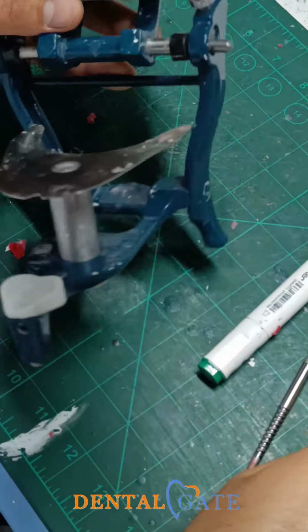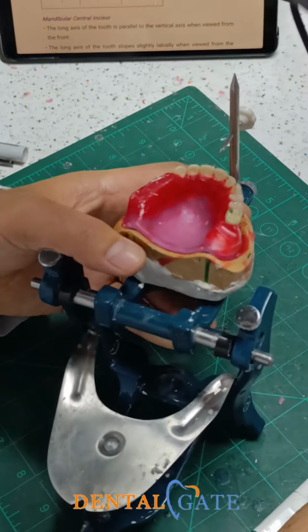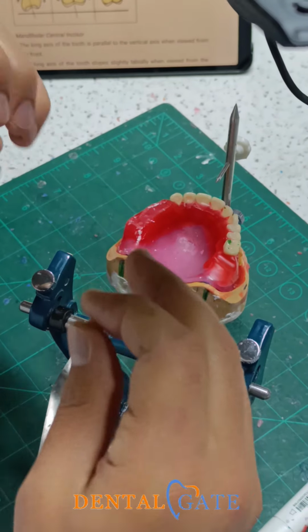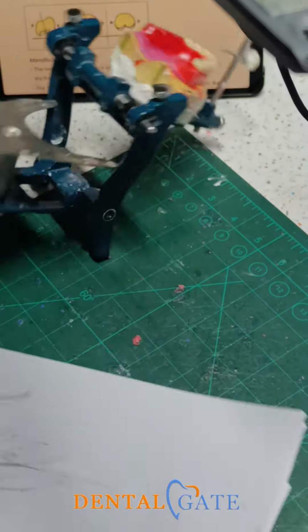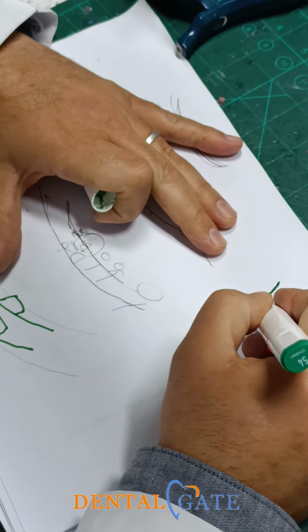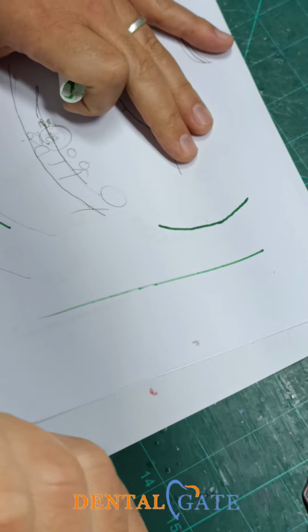So the 7 should follow the tilting, and I start to look for my curve within the crest of the ridge, because I will make this curve accordingly. This is my canine. These are my premolars. There is no straight line in the posterior teeth.